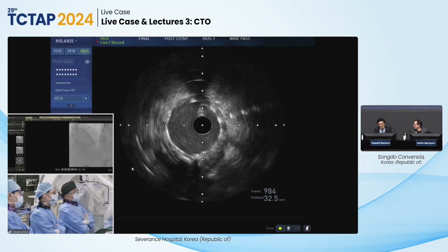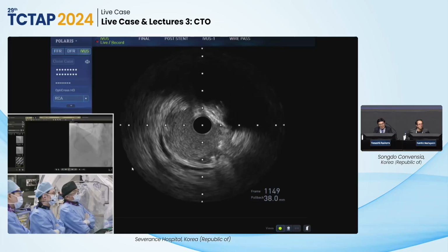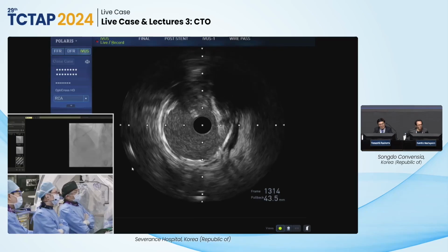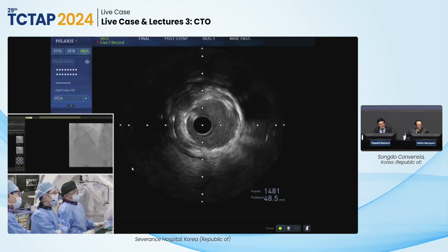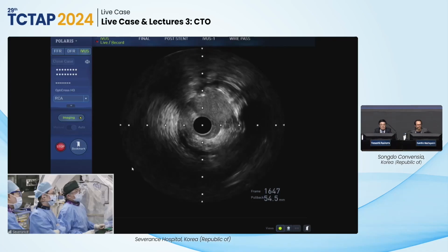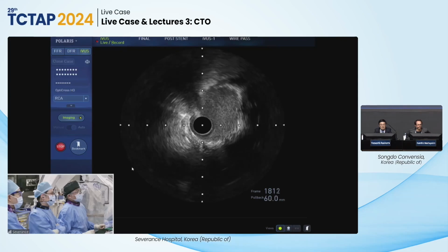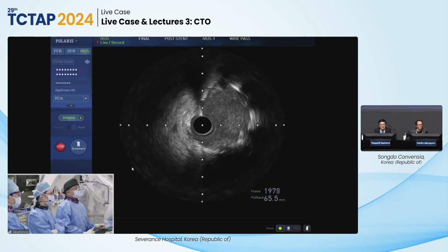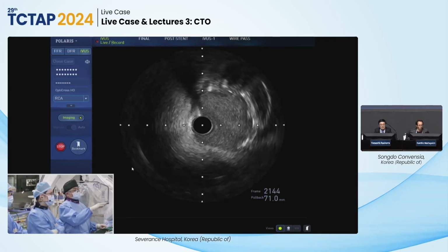And maybe the previous MSA portion approaching. Highly expanded compared to the previous one, and more concentric. Comes now. This is the part. Probably not too much more, but probably a little bit. It's very difficult, right, to get that even more expanded now. But I think there was no major side branch in this area.